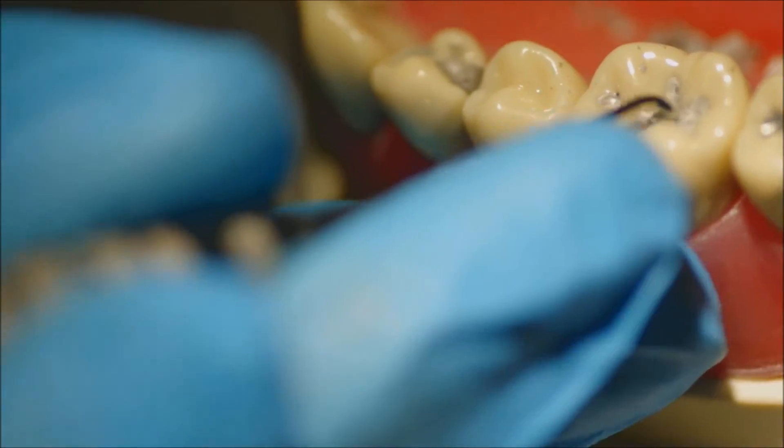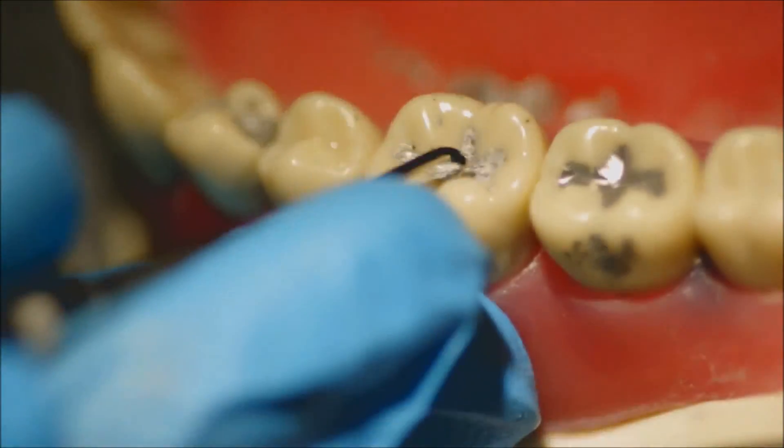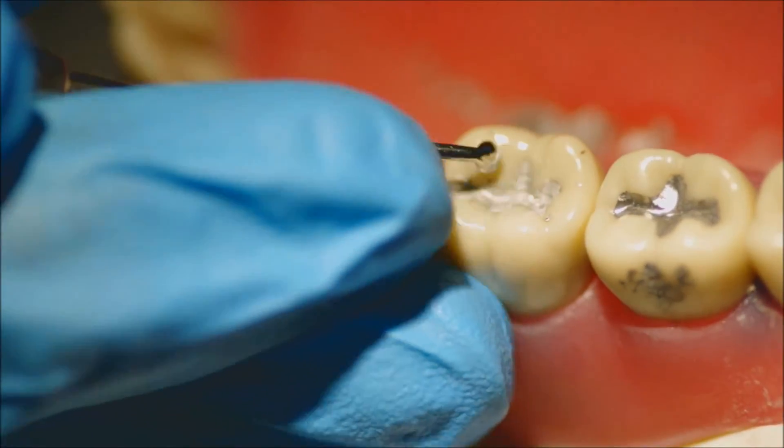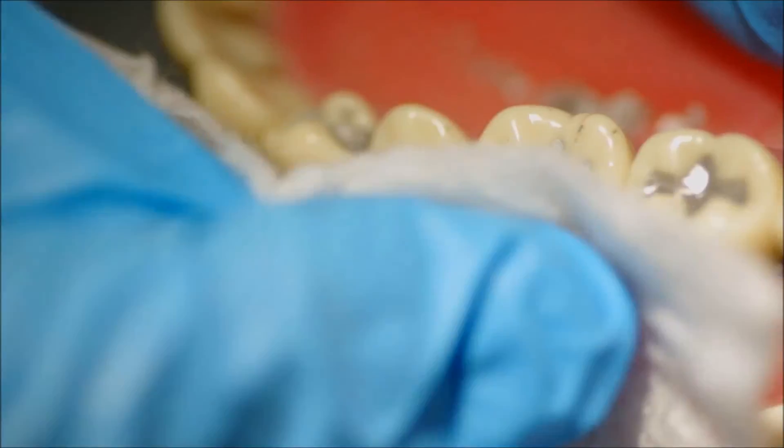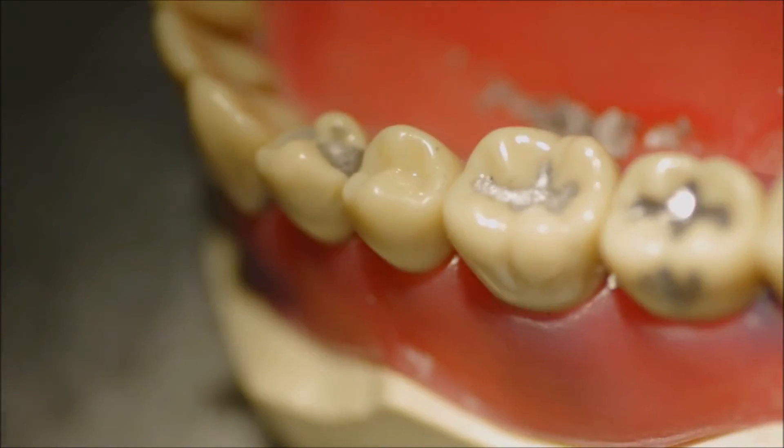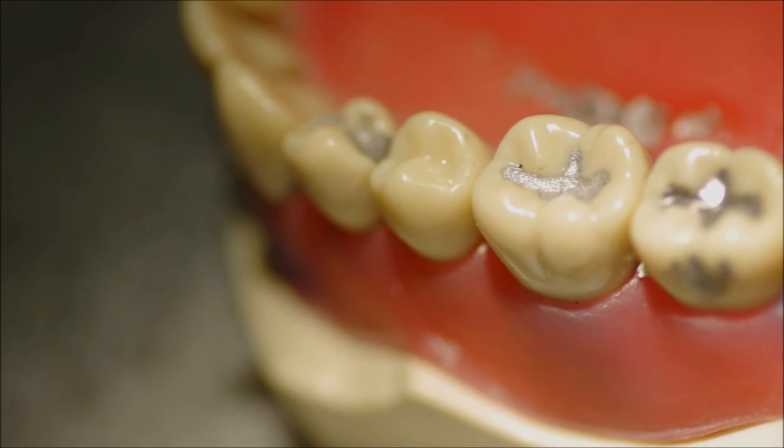What instructors are looking for in the preclinical setting is not the shiny sort of filling you can see on the adjacent tooth number 18. They want to see smooth finish, but it should be matte in color with defined anatomy. And the cleoid discoid lets you achieve that smooth surface finish while retaining your anatomy, unlike the ball burnisher or cotton.